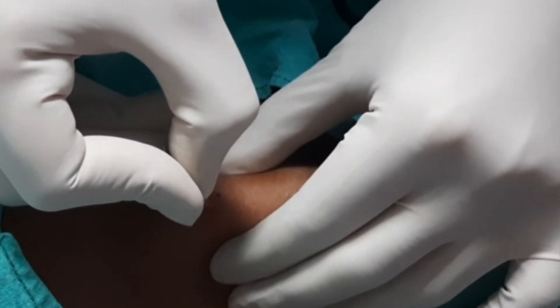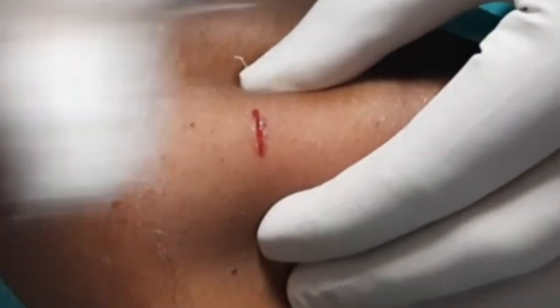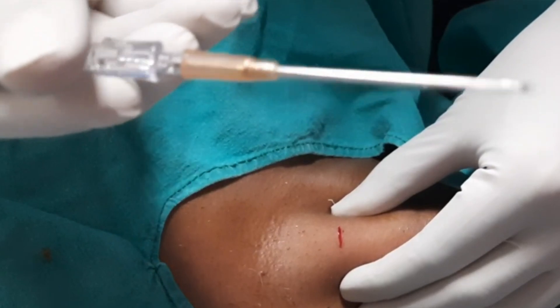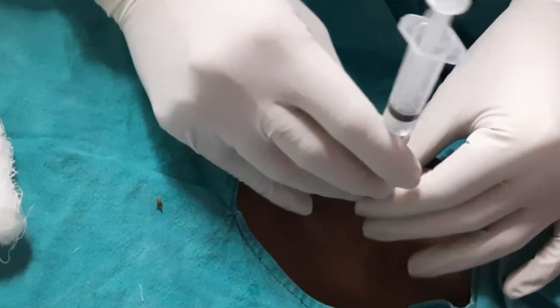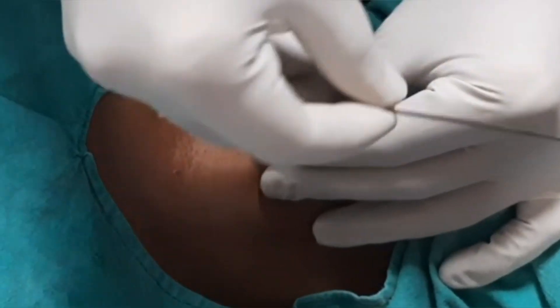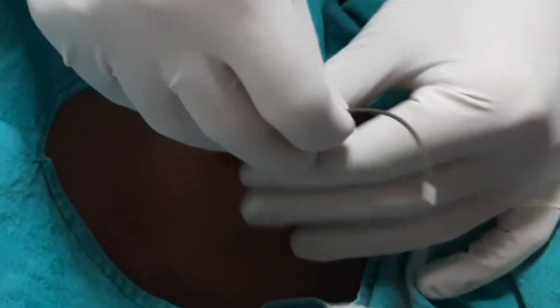Now we will give an incision of 1.2 to 1.5 centimeters. This is horizontal — we have to give a skin incision only; no need to go through and through. Now we will take our assembly of syringe, needle, and sheath. We will insert until we get a give-way feeling and air comes out. You can see the air coming — this is confirmation of our site.